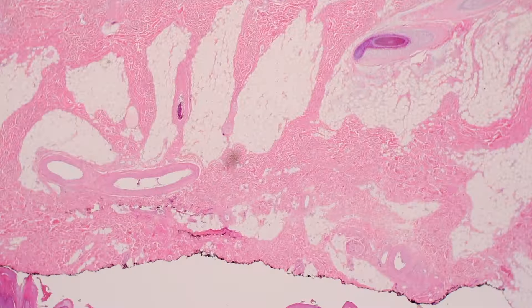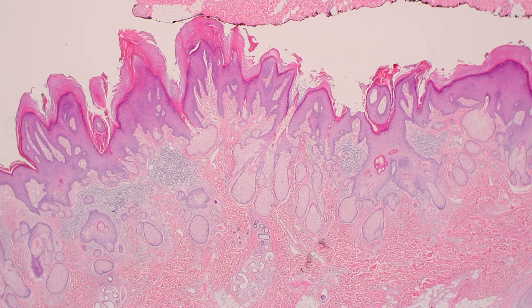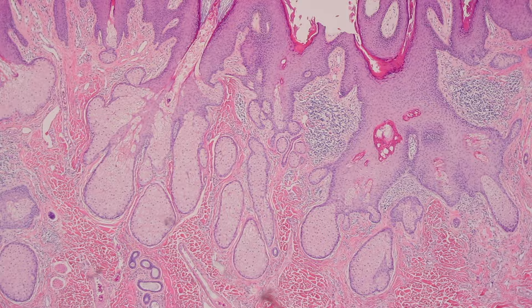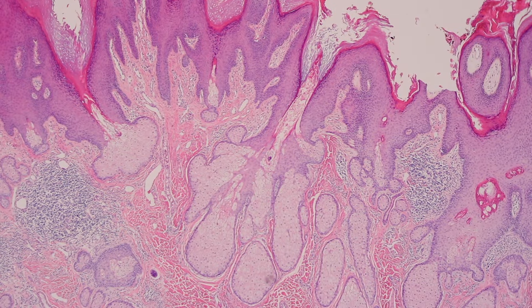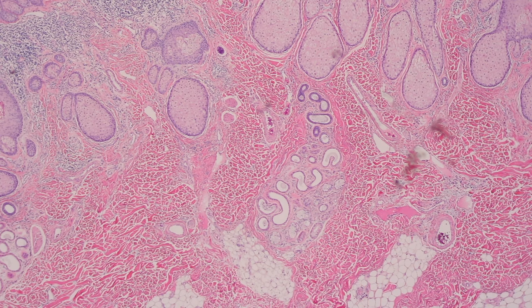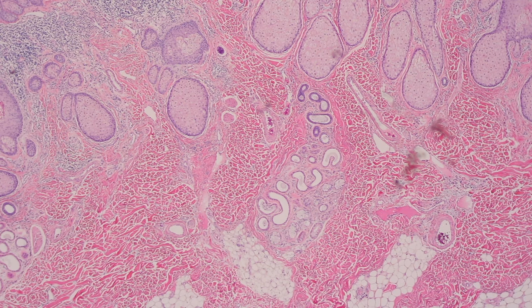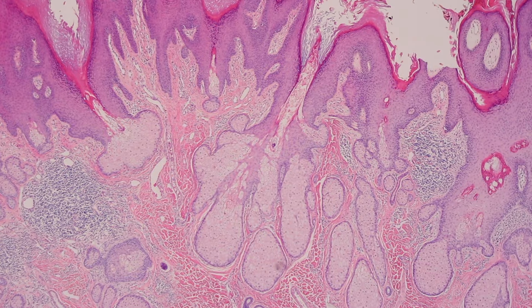Again, here is beautiful epidermal hyperplasia or acanthosis. You've got nice large sebaceous glands draining — look at that, draining directly up to the surface. And then down below, sometimes you'll see apocrine cells in the sweat glands. So that's nevus sebaceous.